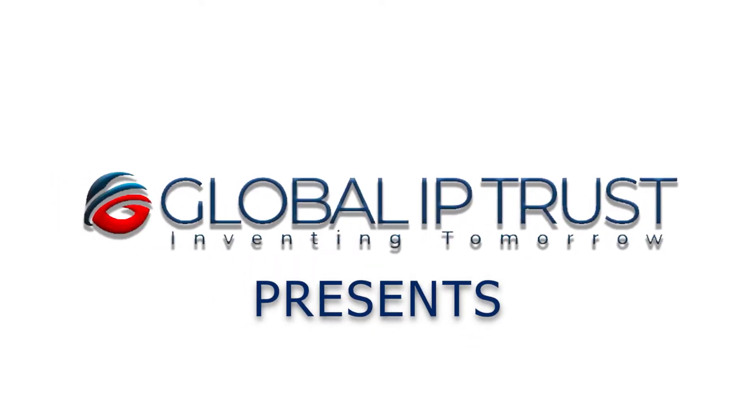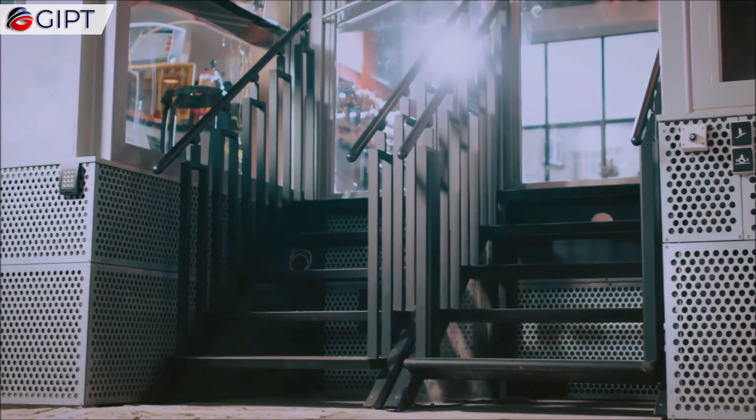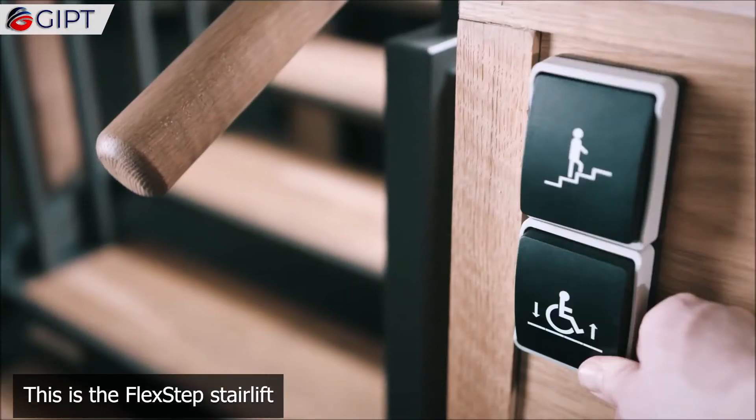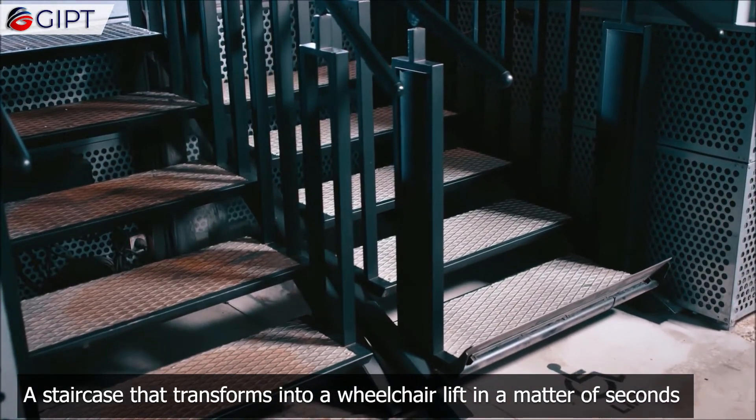Global IP Trust presents the Flex Step — a stair lift, a staircase that transforms into a wheelchair lift in a matter of seconds.